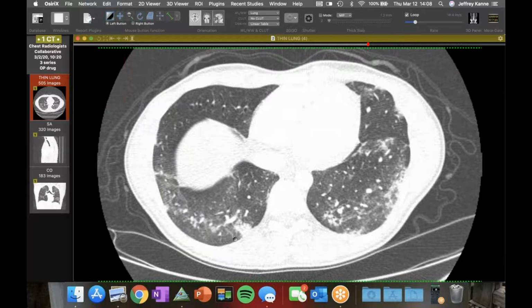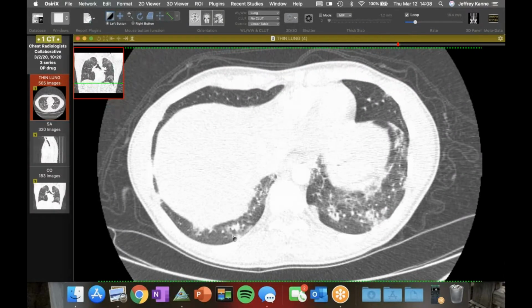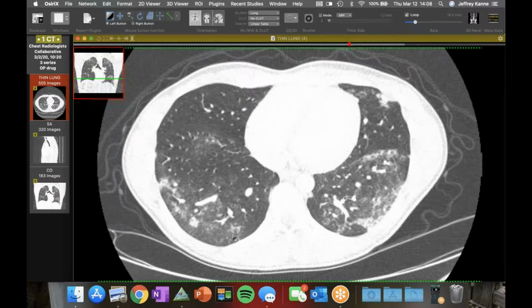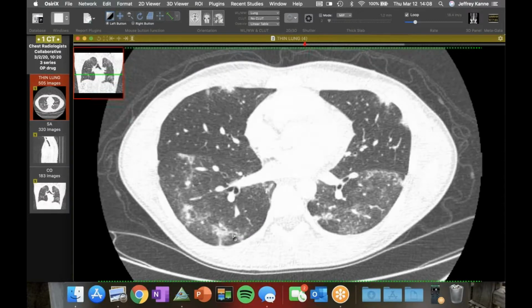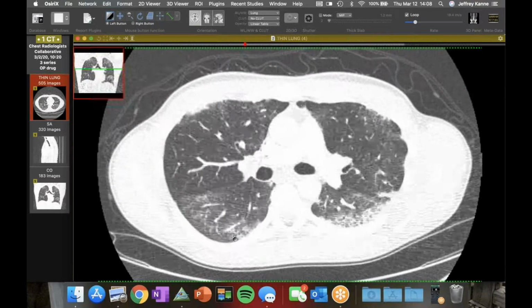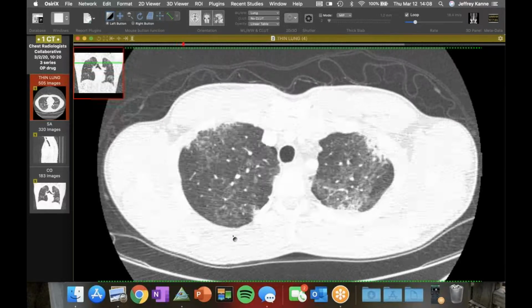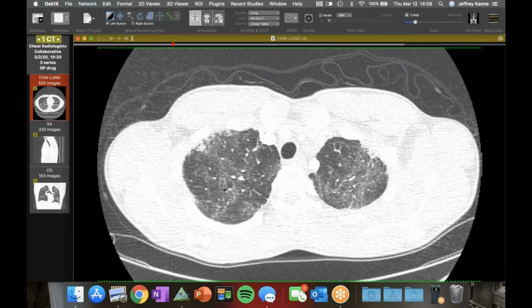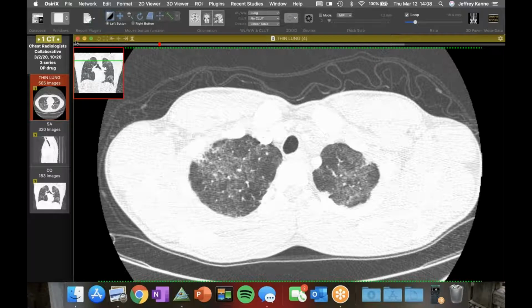This is from bleomycin, which he was on. Standard therapy for most testicular cancers is bleomycin. Surprisingly, he wasn't that symptomatic. I was kind of a little bit surprised, but this is one I see. It affects like 15% of patients on bleomycin, so I have a pretty low threshold to call this if I see what looks like an organizing pneumonia, and it can go on to fibrose. Now, why it's so nodular, I have no idea in this particular case why we're seeing that, but just something to keep an eye on.